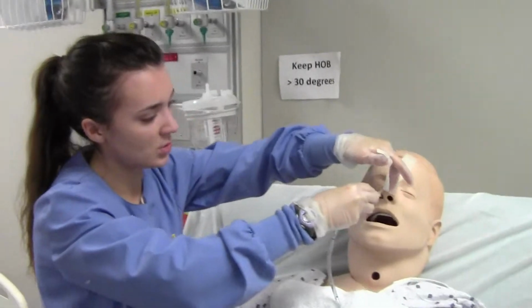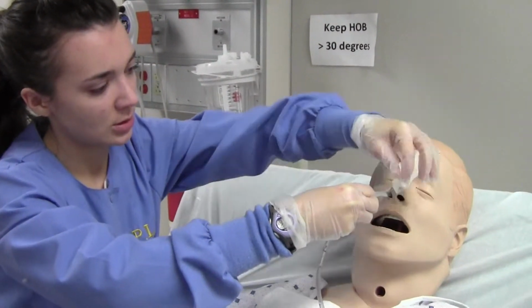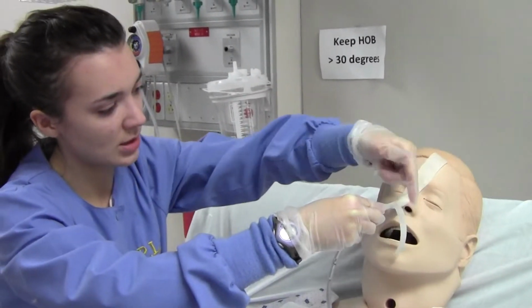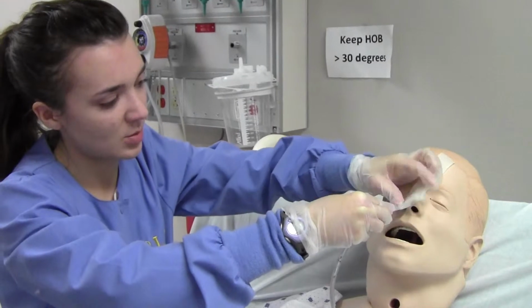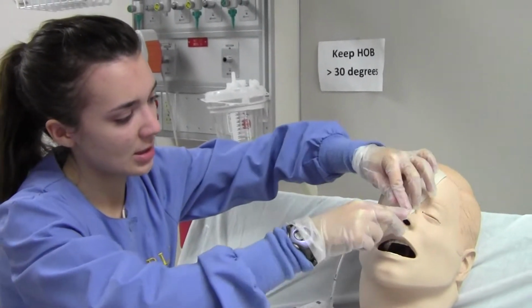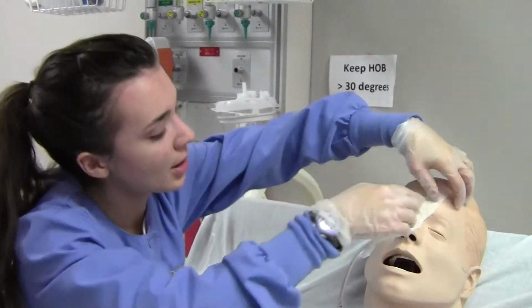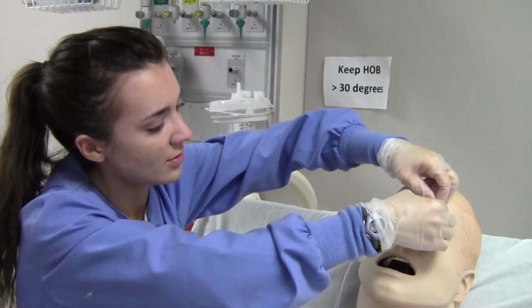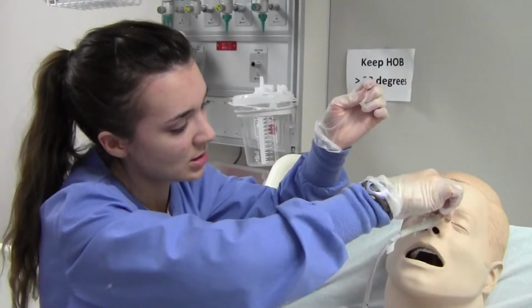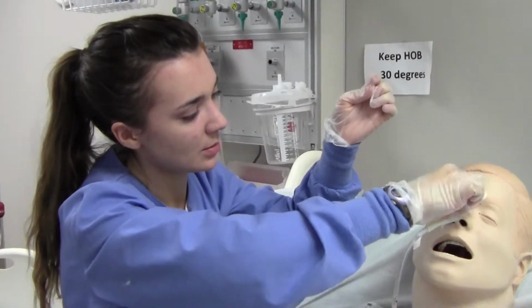Okay, what I'm doing here is called the figure 8. So it just ensures that we have a nice secure tube that's not going to go anywhere, so we don't have to be afraid of you pulling it out or anything by accident. Okay, so that's nice and secured. It's secure on the tip of your nose. How does that feel? Is it bugging your nostrils at all? No? Okay. Trust me, you're definitely going to be happy that this is in place. We're going to cut that down a little bit. Okay, I'm just securing. I know I'm touching you here, but got to make sure it's all in place. Glad you don't mind.